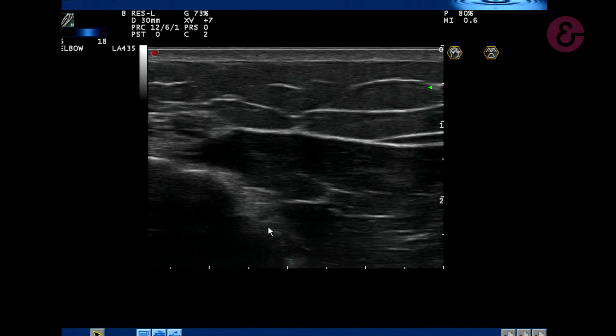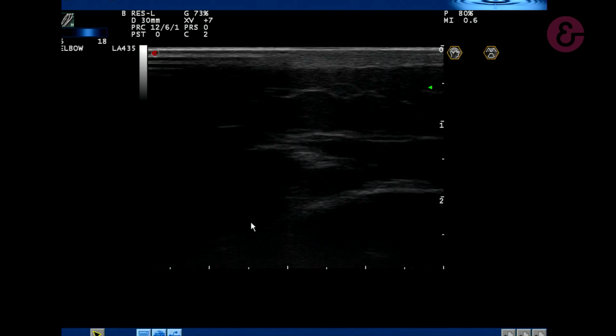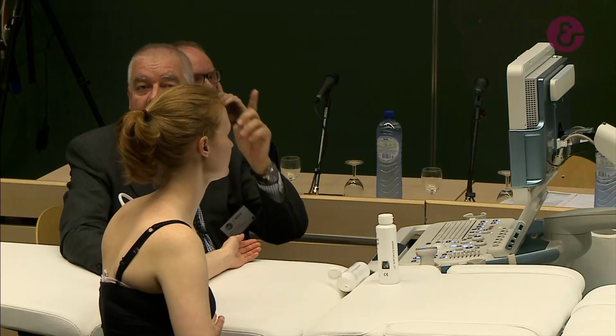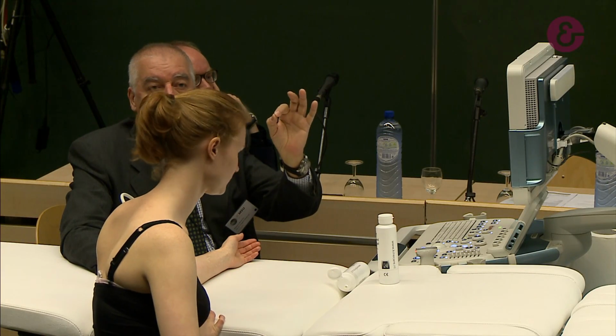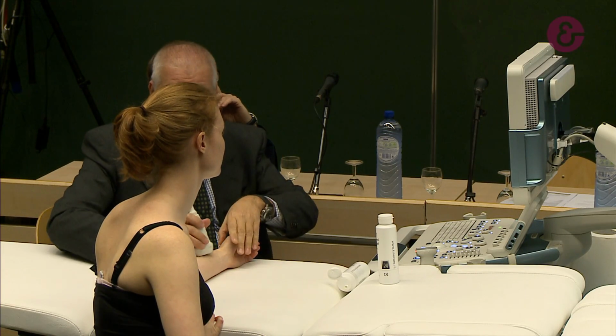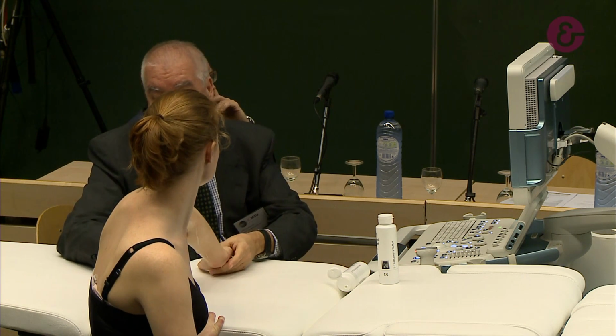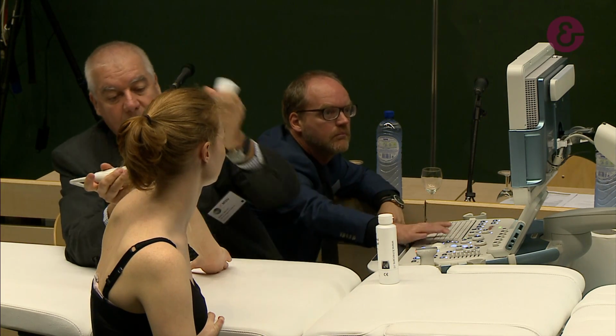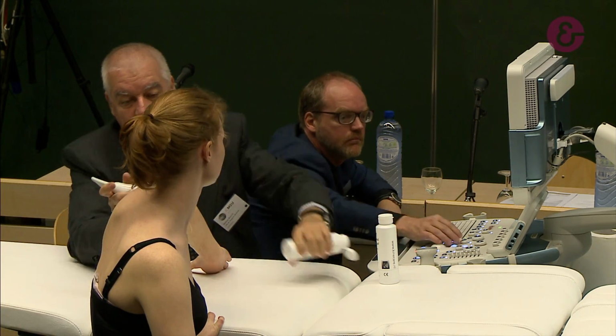And you can move on the arm to follow this. So you can see that the elevator technique works very, very well. So you locate a nerve in an exact level, and you follow up and down. Then we move to the ulnar nerve on the posteromedial aspect. We have to examine in this position, a little bit flexion, and we'll put some gel on the posteromedial.